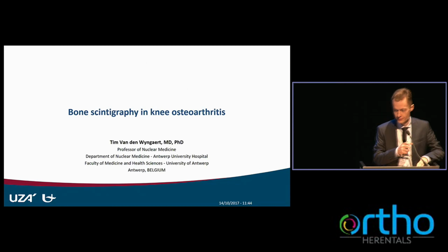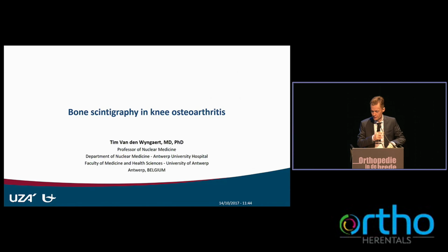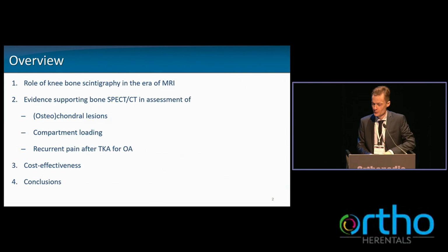Okay, thank you, Stephen, for the introduction. And the scene has indeed been set, but we will be switching gears a little bit and moving back to imaging from a knee osteoarthritis point of view. So I took the liberty of interpreting this title in a broad way. That is, I really want to focus on where I believe bone SPECT-CT of the knee is going, rather than detailing where we are today.